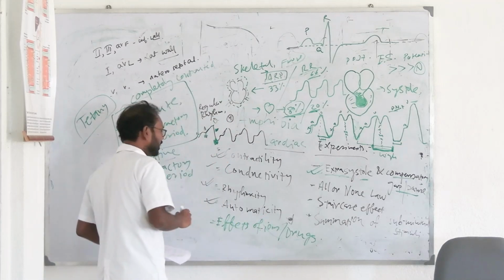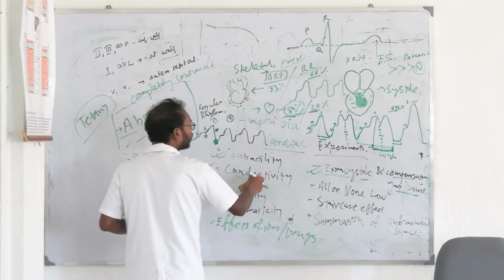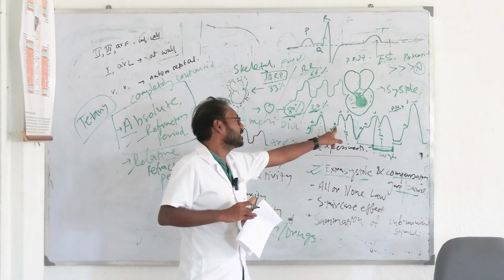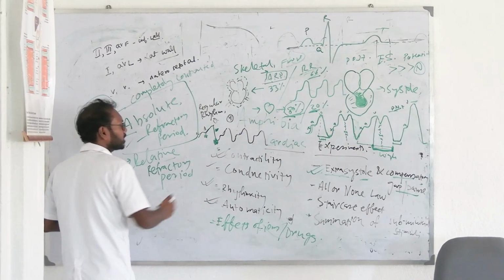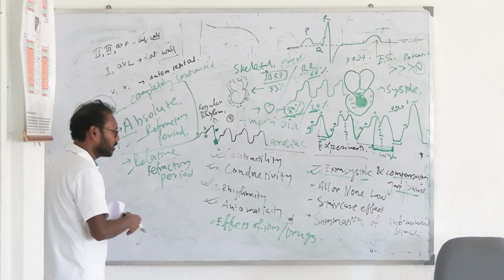stimulus. So first will be, and also conductivity we have seen. There we gave an electrical impulse using the electric board, the stimulus we are giving; if conduction had not happened then extra systole would not have happened, so conduction was okay. So finally we have completed the conductivity check also, right?